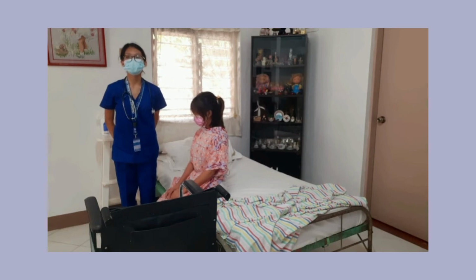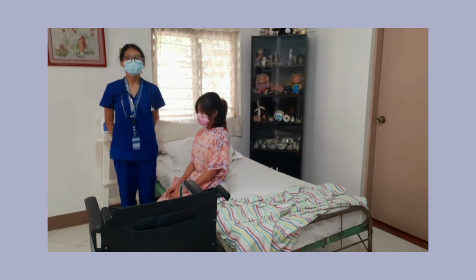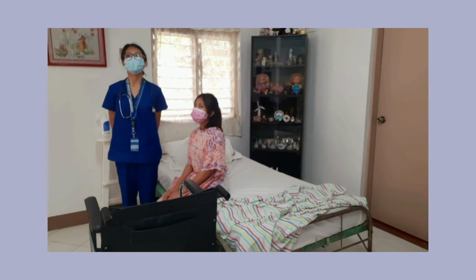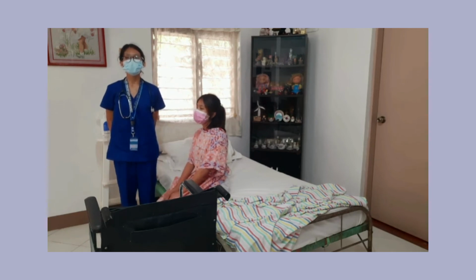Number 6, give explicit instructions to the client. Ask the client to move forward and sit on the edge of the bed. Lean forward slightly from the hips. Place the foot of the stronger leg beneath the edge of the bed and put the other foot forward.